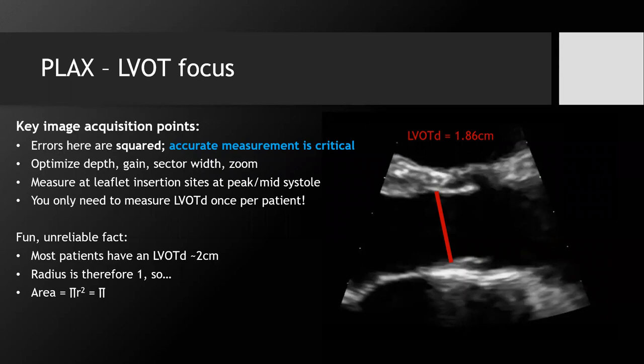And some people will sometimes, especially if you can't get a good parasternal long axis view, hedge on this and say, well, then we could really just look at VTIs. A normal VTI will be somewhere between 18 and 22 centimeters. And if we can't get this LVOT diameter, well, we'll just go based on VTI. But you can be really fooled, especially in people who, for whatever reason, have a smaller LVOT diameter or a much larger LVOT diameter, then their VTI will not apply. Well, you can't really assume that their VTIs are normal. And then you're making all these wrong assessments based on that assumption.